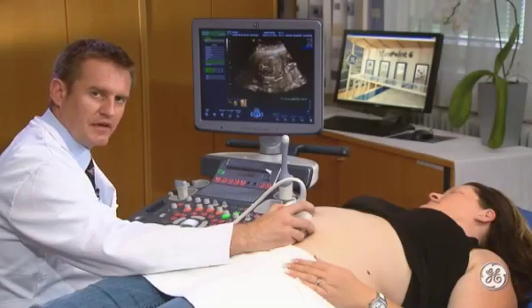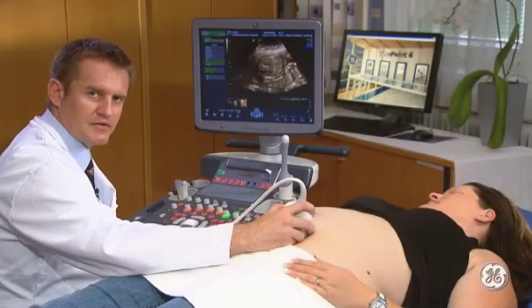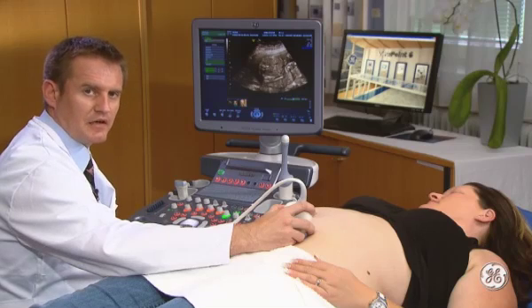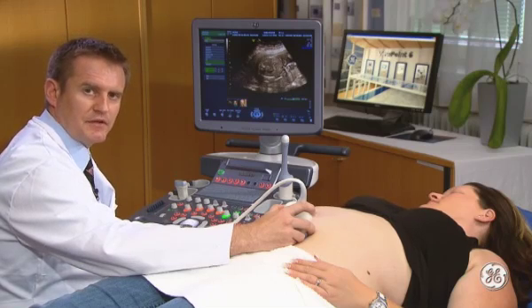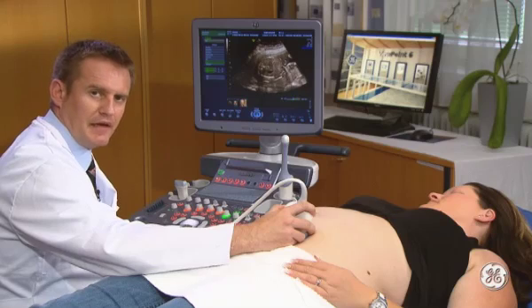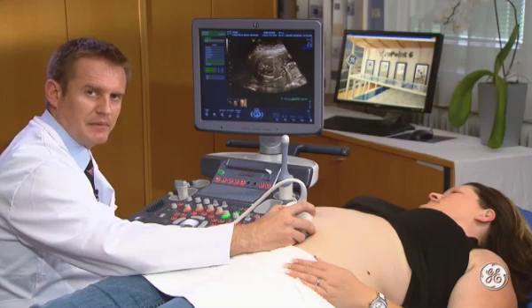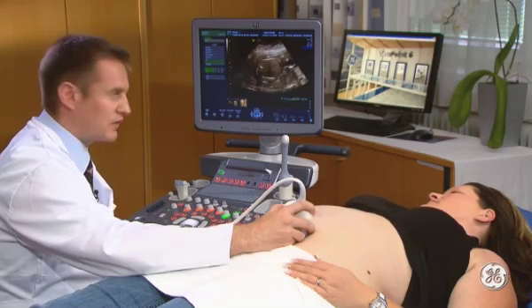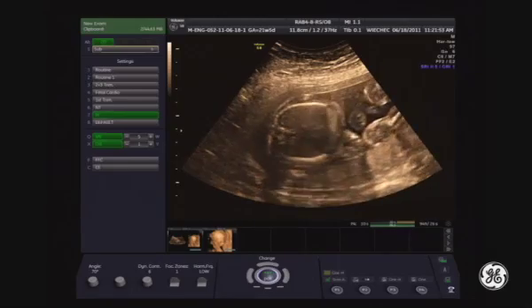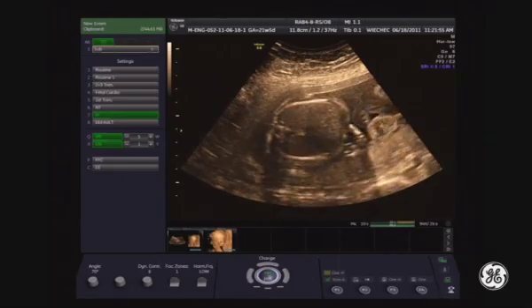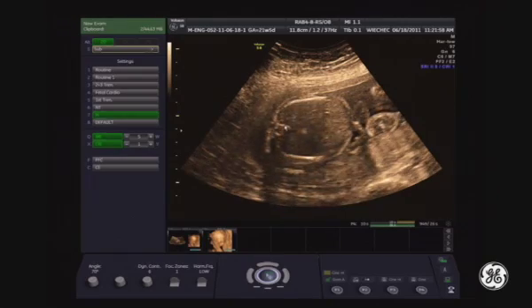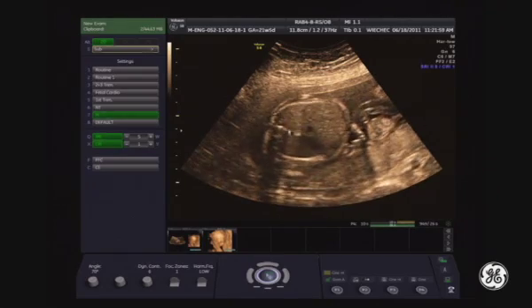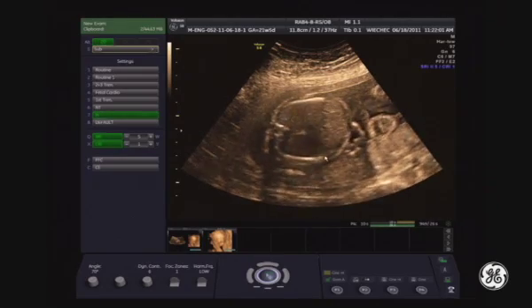For diagnostic 3D, good scanning skills are very much required in the case of the fetal spine. The examiner should check at the beginning the position of the fetal spine in transverse view, to see the position of the spine in axial view of the fetal trunk.